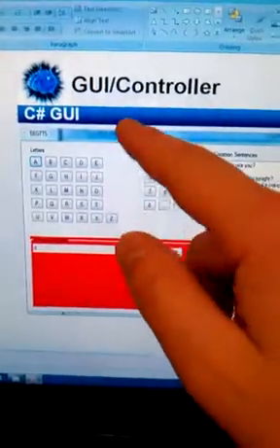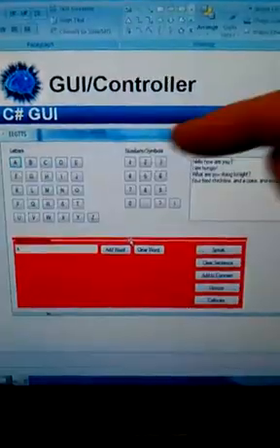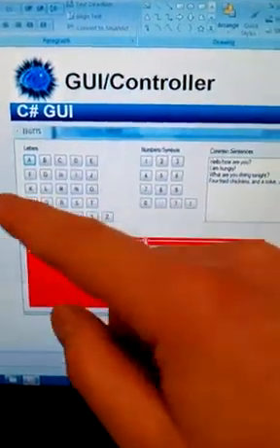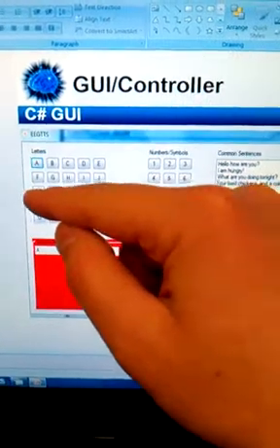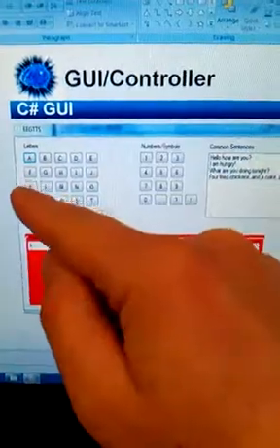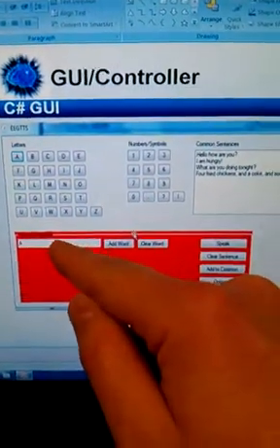And then for instance, if the letters was selected, it'll go into the letters section and it'll start highlighting rows of the letters, and then do that 5 times, average the signal, find out where an ERP was. So if I was looking at M, it would then use the M row, and then it'll go in and highlight all the columns. And then whatever one we're looking at here, if it was M, it would select the M and then put it in here.